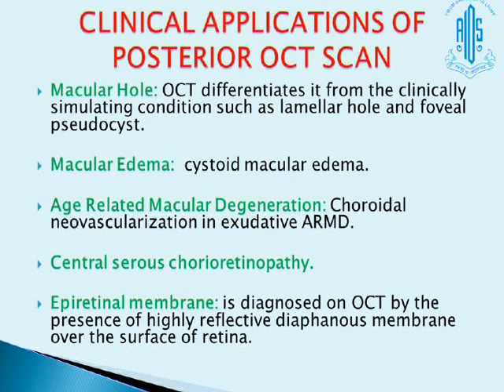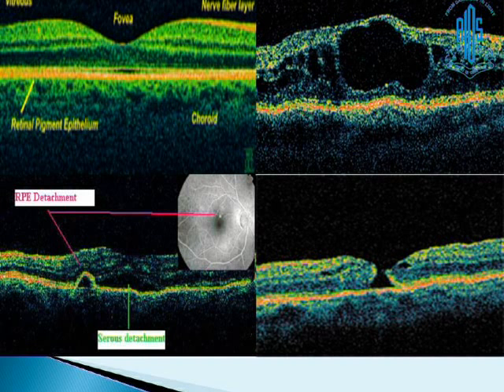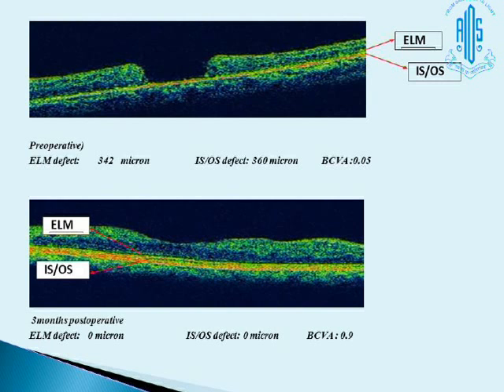Clinical applications posterior: we have macular hole, macular edema, age-related macular degeneration, central serous chorioretinopathy, epiretinal membrane, and also retinal pigment epithelial detachment and serous detachment. We have some pre- and post-operative examples.